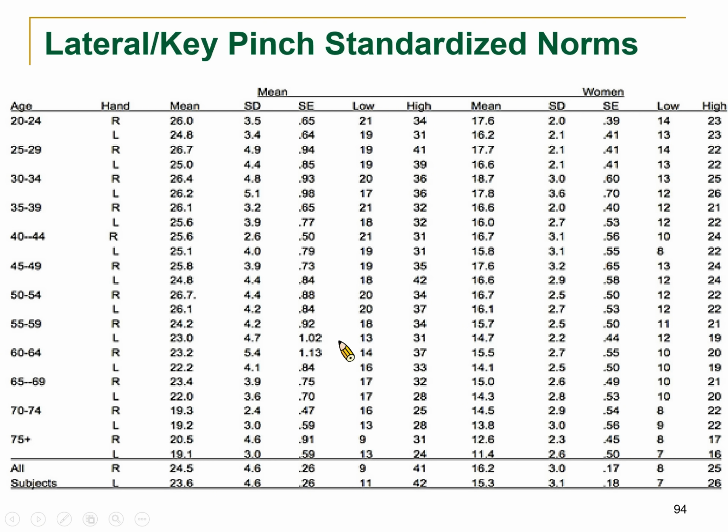So what is the importance of grasping and pinch power? 为什么我要跟各位讲这个东西？If you are designing a prosthesis for a man like you, with similar height, similar power, and similar gender, what is the reference you should take?